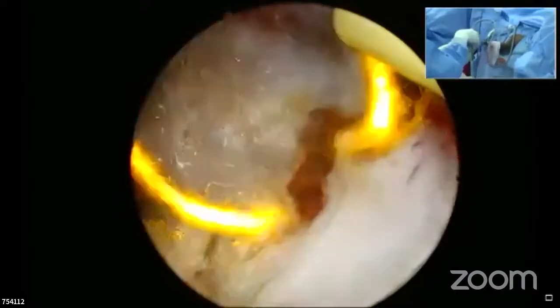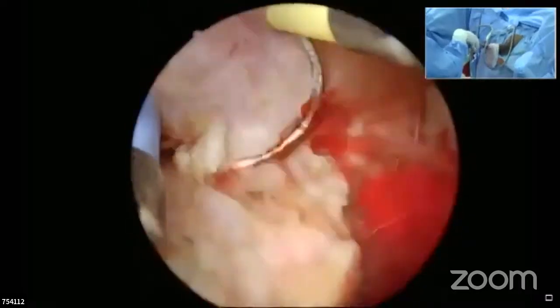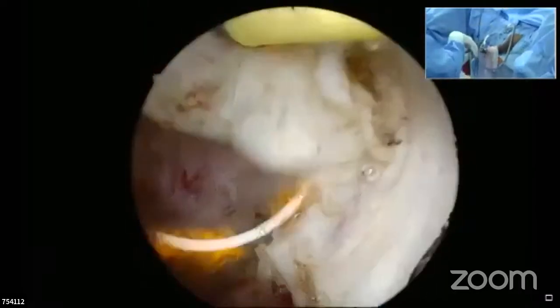Functional urethral length 1.5. Bulking agent we have already discussed. I think we should not use it.